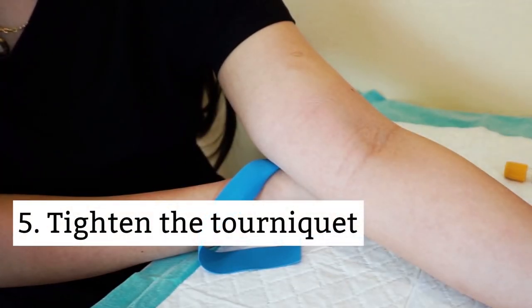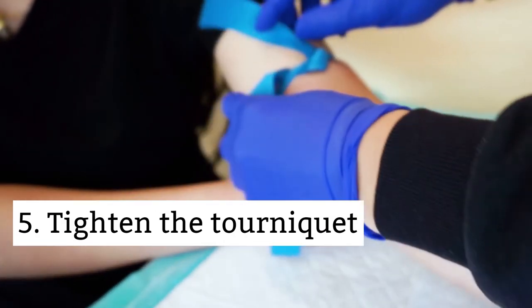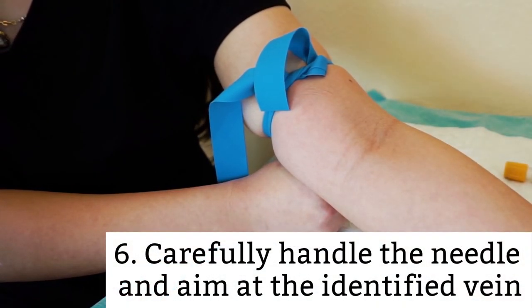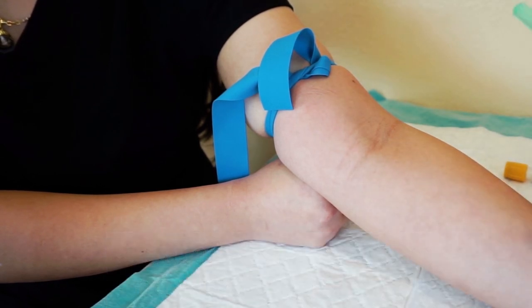Fifth, tighten the tourniquet 3 to 4 inches above the drawing site, making sure that the tail of the tourniquet is away from the site. Sixth, carefully handle the needle and aim at the identified vein. Keep your eye on the bevel. The bevel should be up and the pointed end of the needle is aiming at the vein.